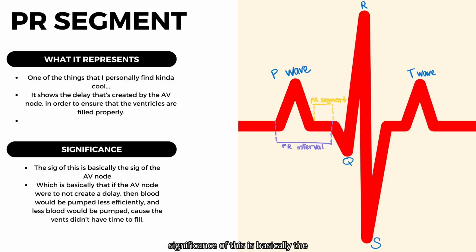And the significance of this is basically the significance of the AV node, which is that if it's too short, then we know that the AV node isn't creating enough of a delay. If it's too long, then the AV node is creating too much of a delay, etc.